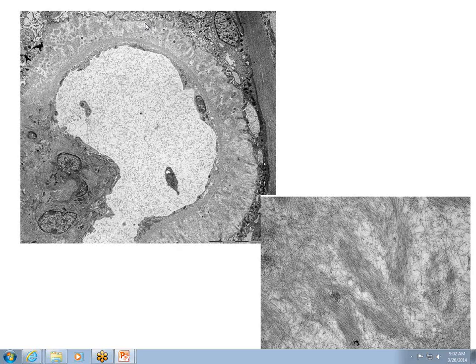And I believe the case that you presented, Rachel, was hypertensive. This case, the first case. Yeah. And that's the other thing: with the first focal segmental glomerulosclerosis case, that dog was hypertensive. So whether that was an adaptive pathogenesis, where the glomerulus had started to scar down because of hypertension, or whether it was a primary process, at this stage we don't know. We can just put it into the pattern of disease, and then we can start to see how these animals group together. Do you guys have any questions?